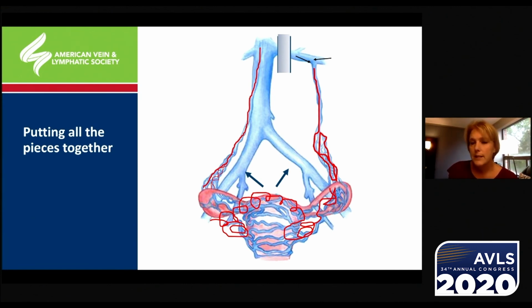Now, ultrasound can't help determine that for us, but it can give us a few hints. And one of the hints could be that if you have spontaneous, continuous retrograde flow in that left ovarian vein, then that can be indicative of the fact that the left renal vein compression is actually fairly significant, because it's a constant retrograde flow versus one that we augment to make happen. So we're going to move on.